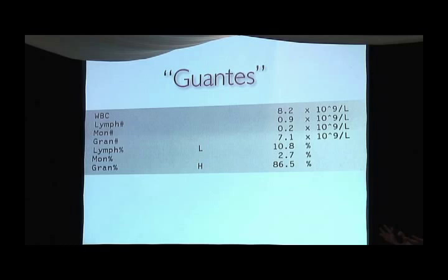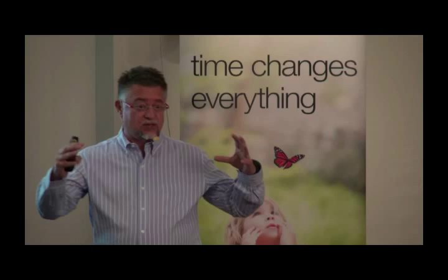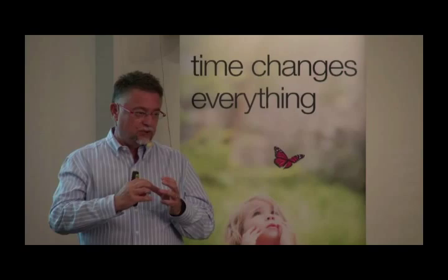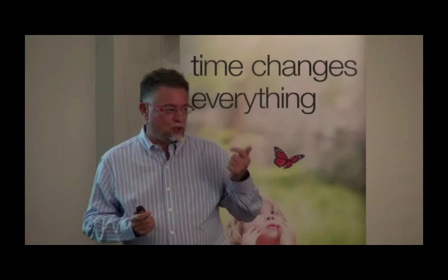I didn't show you leukocyte histograms from an impedance counter, but that's the way they should look, and they look about the same. The only issue is the instrument didn't cut them where they should. You guys remember, when you look at a blood smear, the monocytes are really big, okay? But when they're floating in the blood, they are smaller than a neutrophil, because on the glass they really stick and spread in every direction, all right? So in a histogram for leukocytes, those are lymphs, the valley is the monocytes, and the second hump is the neutrophils, all right? So normal values with normal graphics. You look at that and your conclusion is, I'm not worried about the leukogram in this cat.